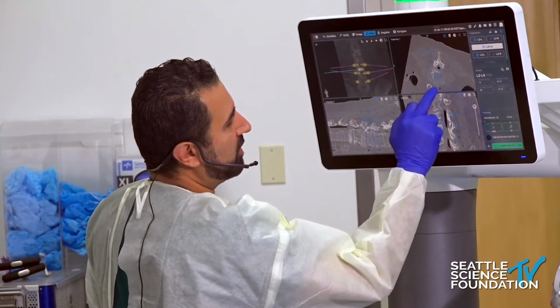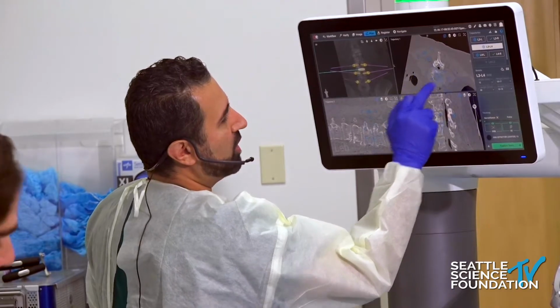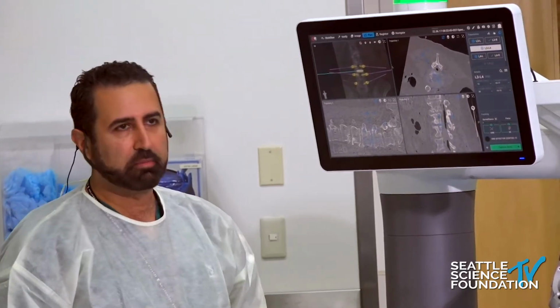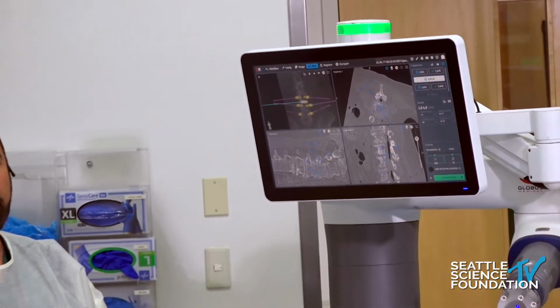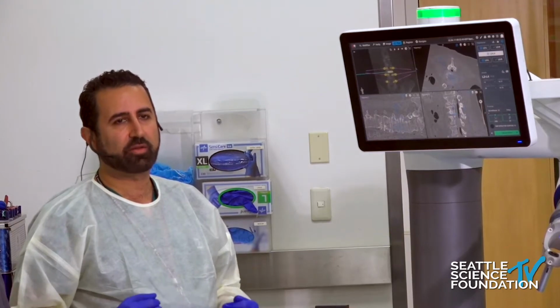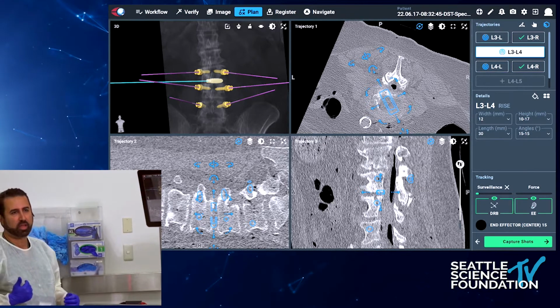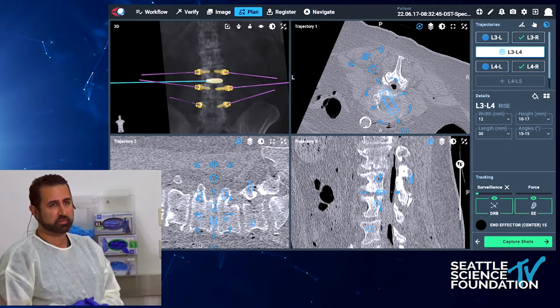What that does for me, obviously, is two things. It provides a pathway for navigation, not robotics, but navigation for that interbody, and it minimizes X-ray. It's one step where I can minimize the impact of X-ray on my body. And as I age, as we all age, we want to reduce the radiation. I know Paul Park and others don't even wear lead. I have drastically cut down the use of lead. And for my final shot, it's me stepping away 6 feet and behind and looking at the final pictures as a verification. So I've minimized the use of lead in my cases. Thanks.